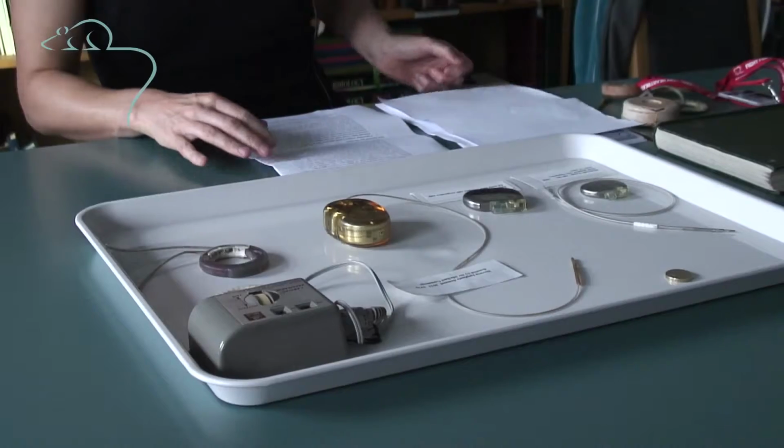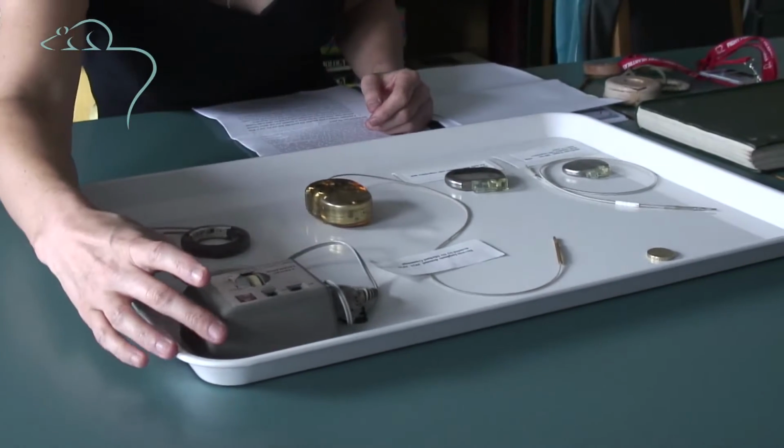So in the UK, pacemakers have been implanted in babies as young as 5 days old to people who are over 100. About 25,000 pacemakers are implanted in the UK each year, and around 3 million people worldwide have a pacemaker. So this is the Abraham Lucas pacemaker.